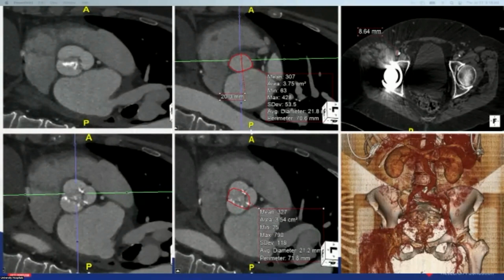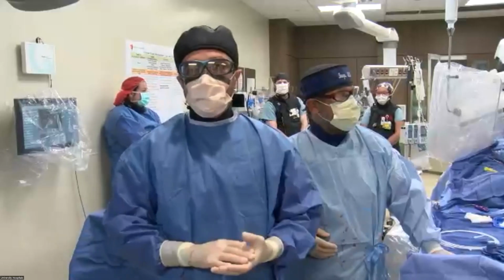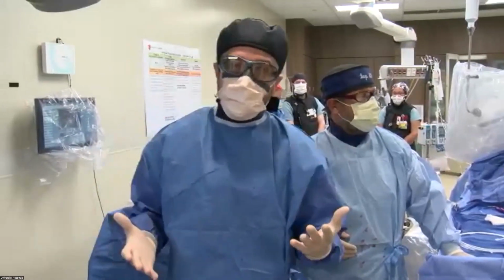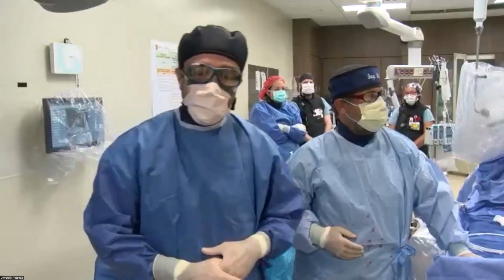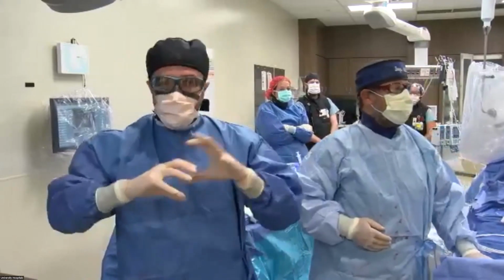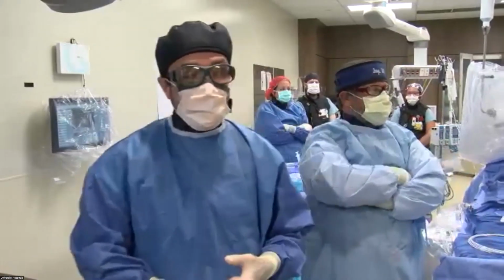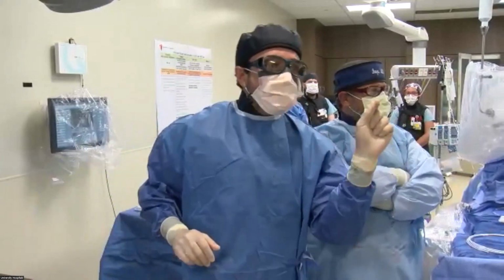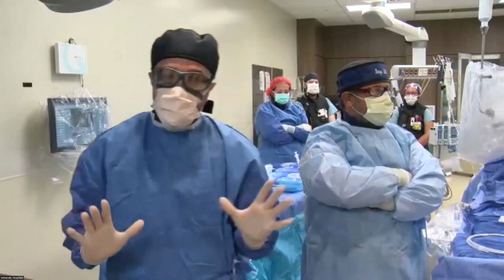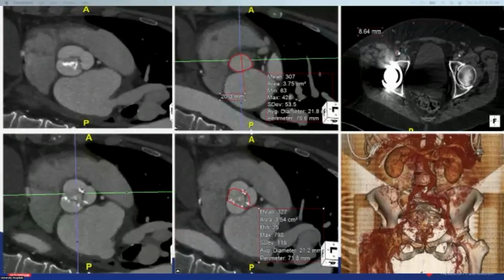Let me interrupt you one more time. Another important aspect to consider here, as you know very well in India, is the phenotype of the bicuspid valve. There are bicuspids and bicuspids. There's a classic paper from our former fellow Suhanyu showing that those bicuspids with very heavy calcium and nasty calcium distribution carry worse outcomes. In this case, there is a fusion between the right and left. However, the raphe is not very heavily calcified. There is some calcium there. So this would be a benign phenotype for a bicuspid valve. And those are the measurements that we have there.